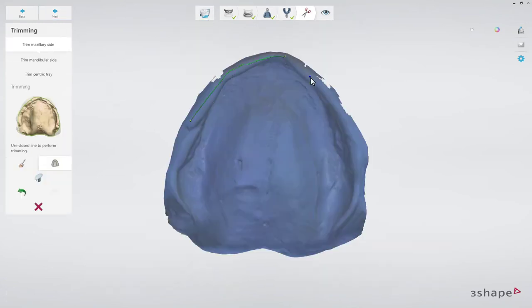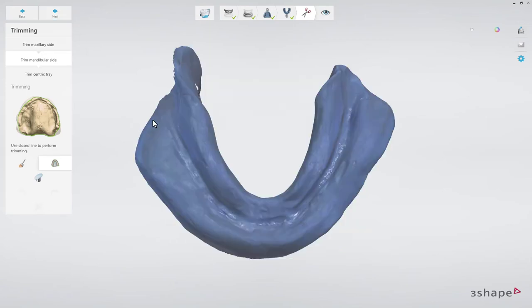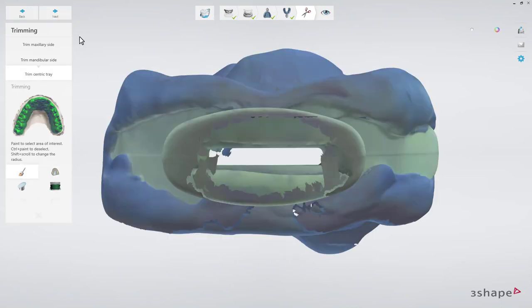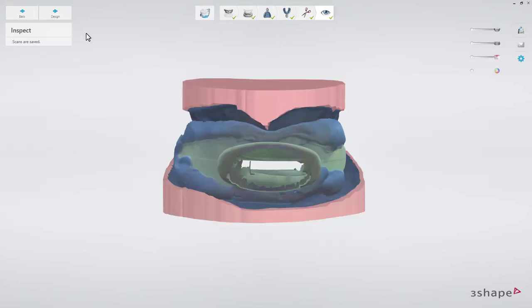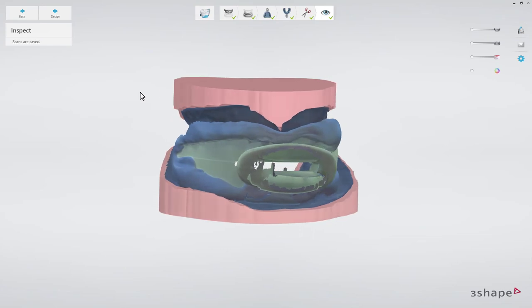Select the area of interest and with the help of the trimming tools, trim the maxillary side, mandibular side, and the Centric Tray. When trimming is done, you can inspect the scans, save the result, and start the designing procedure by clicking the Design button.